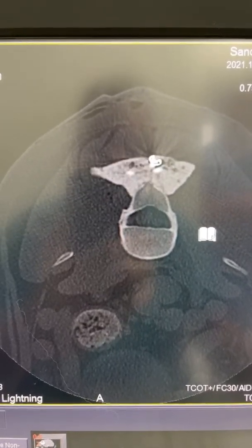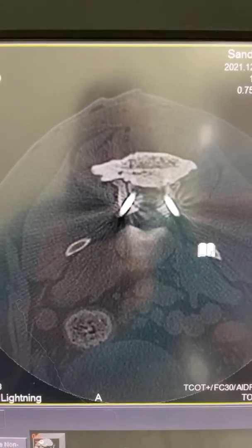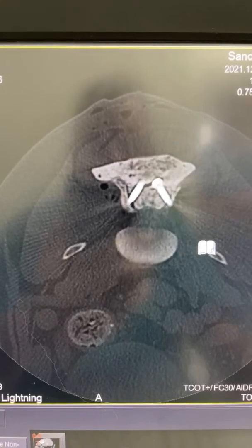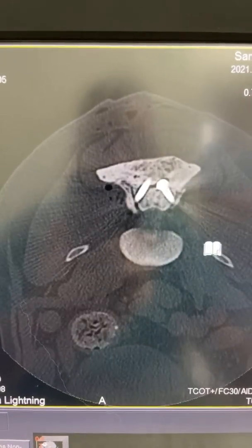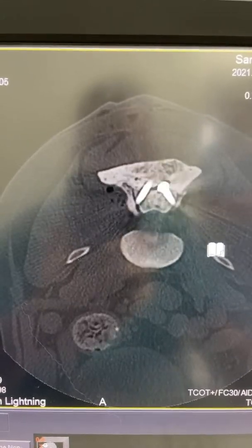Heading farther caudal, we've got another set of screws and these are in the articular facets right here. They're really well-placed screws that are traversing the facets and should provide some stability. They're also engaging the cement really nicely.